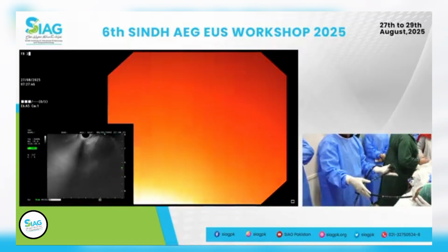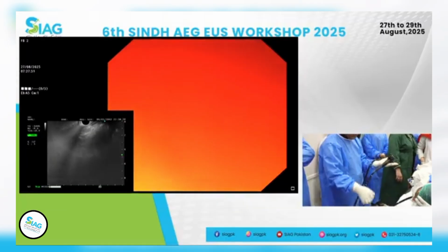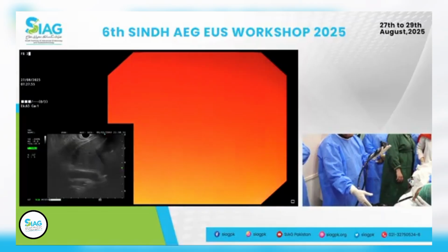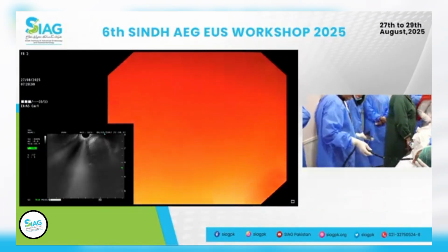This is the left and right torque. You see that, how it's happening? What I'm doing is a little bit of torquing there with my wrist, with my arm. If I need to do further, I can do this. I can go this way.